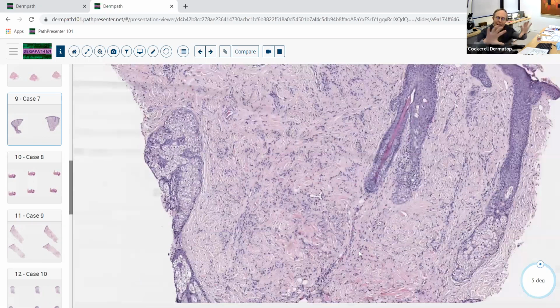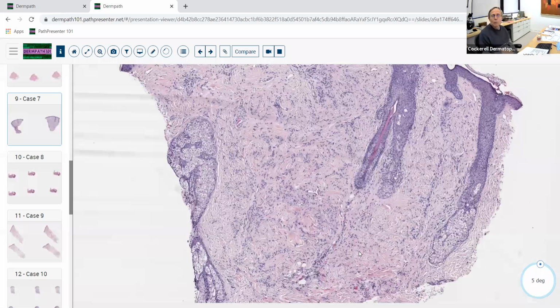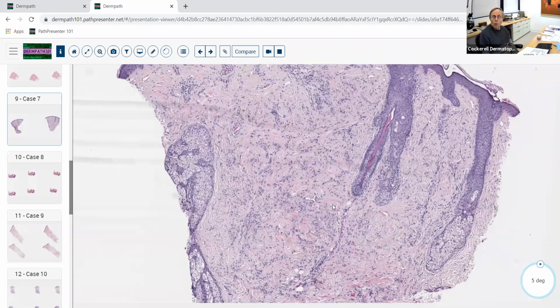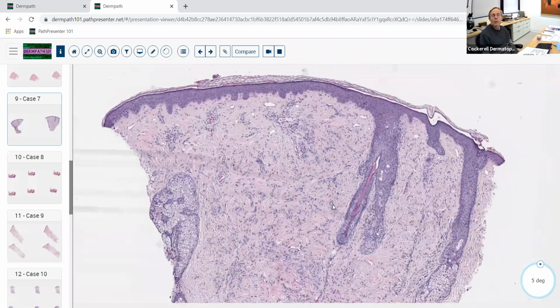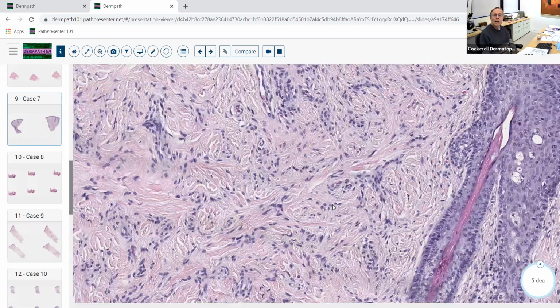They're kind of splayed diffusely in an interstitial mostly pattern in the dermis. And this is what's very characteristic of scleromyxedema that we talked about previously. And again, there are several different forms of scleromyxedema. It can be associated with a paraproteinemia, so you always want to make sure your patient doesn't have an underlying monoclonal gammopathy if you get this diagnosis.